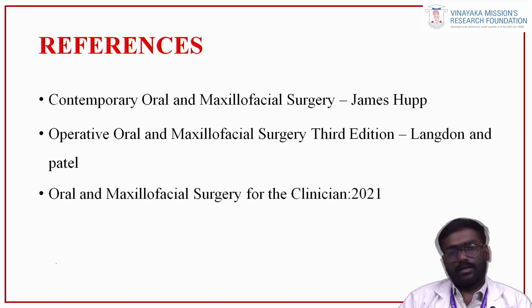So let us quickly summarize what we have seen now. Apicectomy is a common day-to-day procedure that everyone can be doing in our dental practice. It doesn't need a specialist; it is not only oral and maxillofacial surgeons who should be doing it. If you know the principles and the steps, even a dental surgeon can perform it. We have seen the indications, like where all this procedure can be used: failed endodontic restoration, and a large periapical lesion or a granuloma which has been there for a chronic period of time, are the common indications.